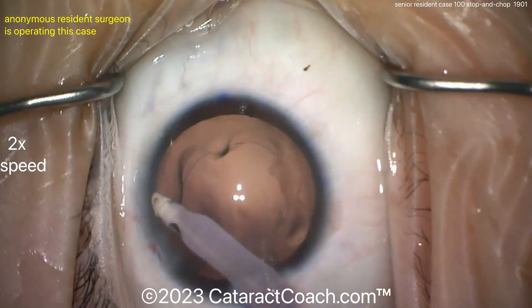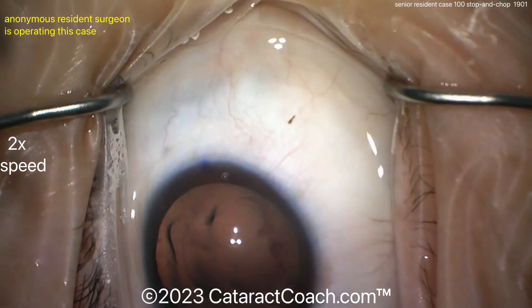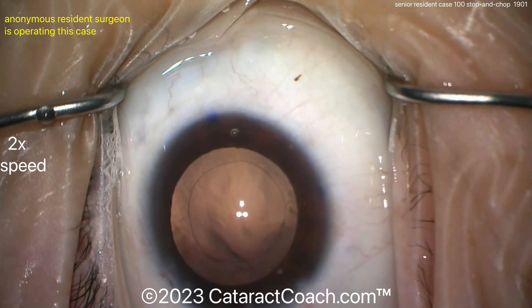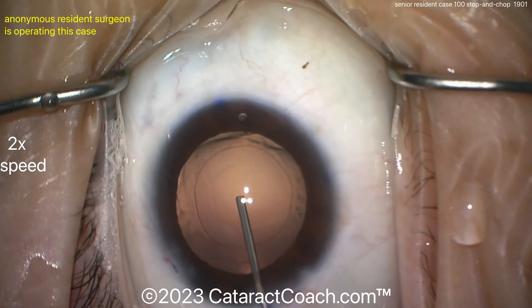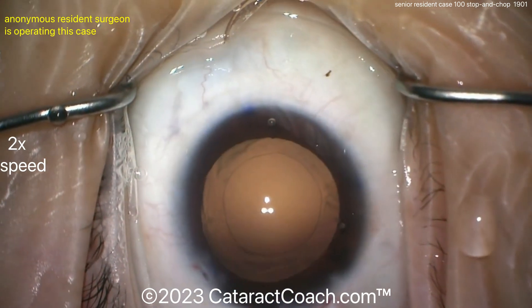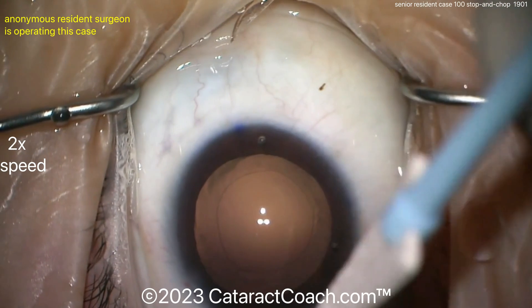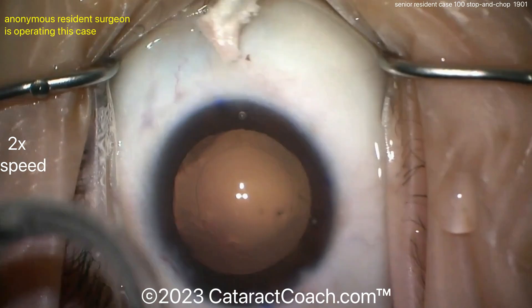Very nicely done — wow, this is quite impressive. If you're not at this level at case 100, that's okay — don't be worried. You don't have to compete with this person; compete with yourself. But this is a good benchmark. If you can get to this level by the end of your residency, that's a solid foundation. If you get to this level by case 100, even better.